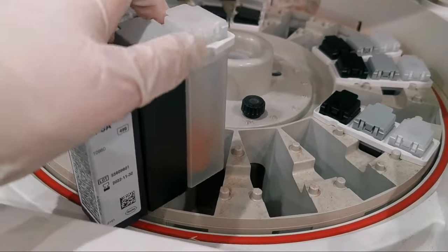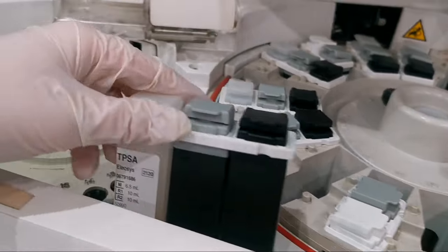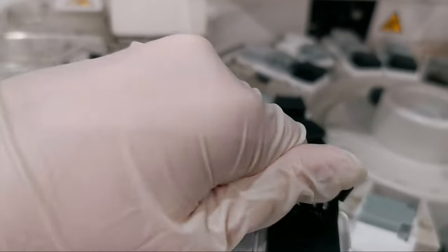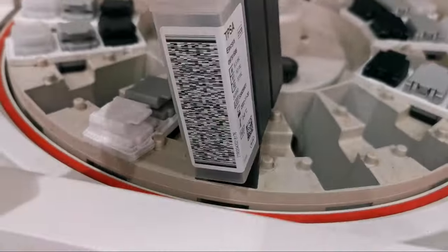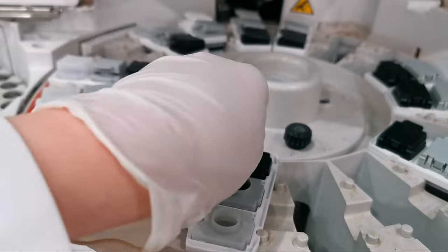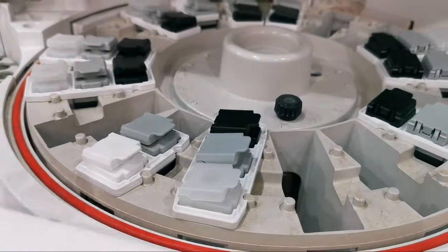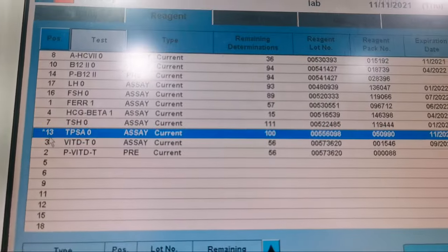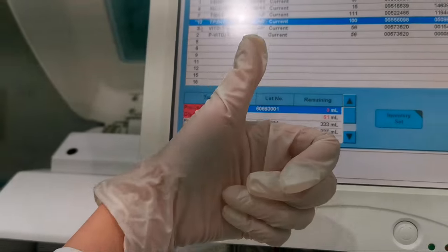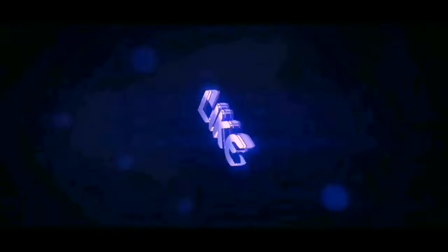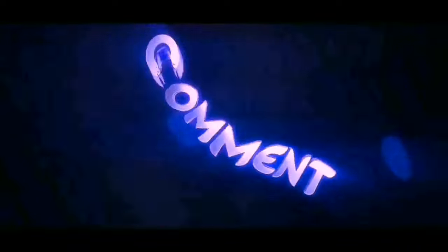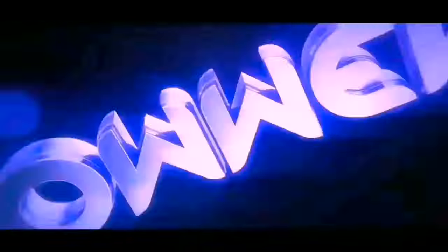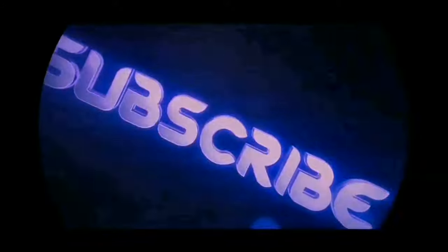Put the reagent on number 13 and don't forget to open the cap. Press Enter.